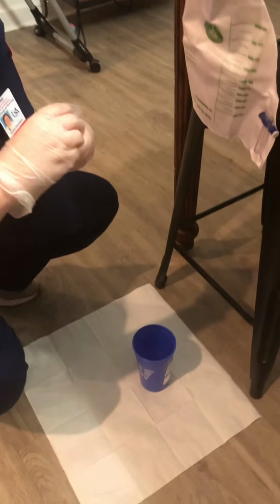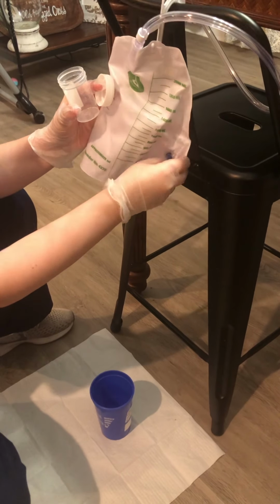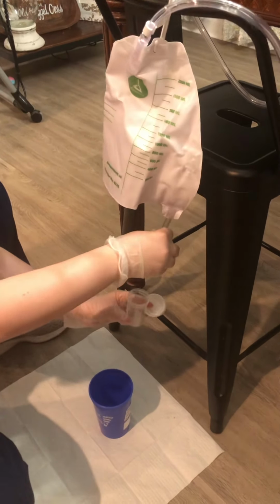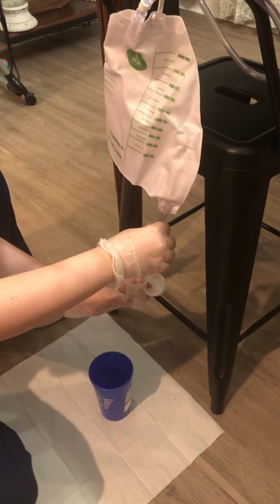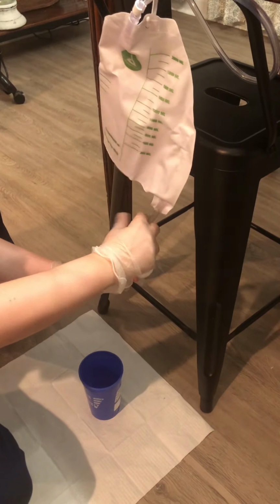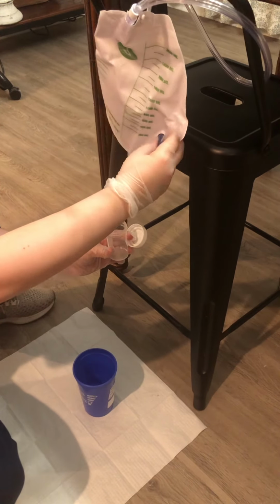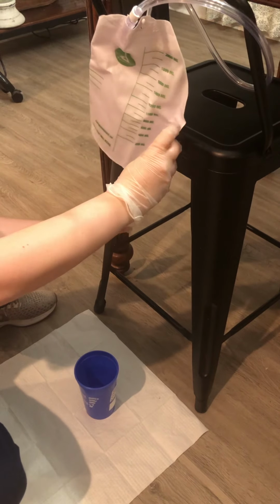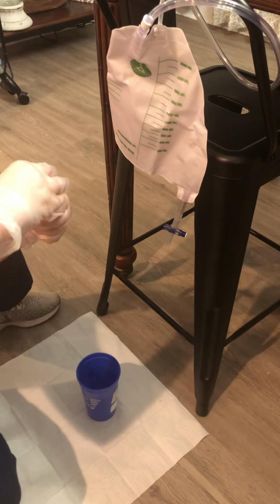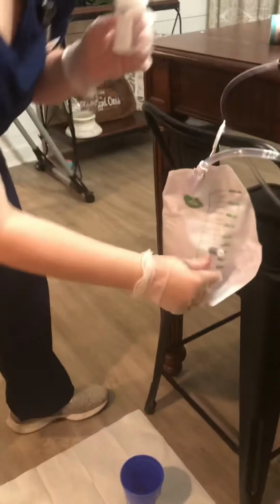I'm gonna open my container up, and then to get a specimen collection, I'm gonna take this down. I'm gonna shift it so that it will open, and it's just gonna drain into my specimen cup. Any excess will drain into the graduated cylinder. After I'm done, I'm gonna close it. And so then I would connect it back up to this. I would close my cap, seal my cap, put my label on it, and then I would send it off.